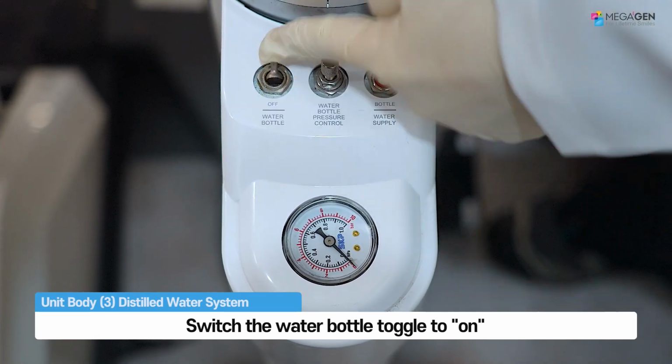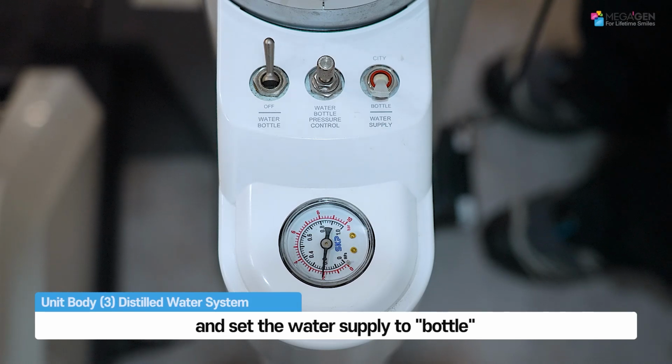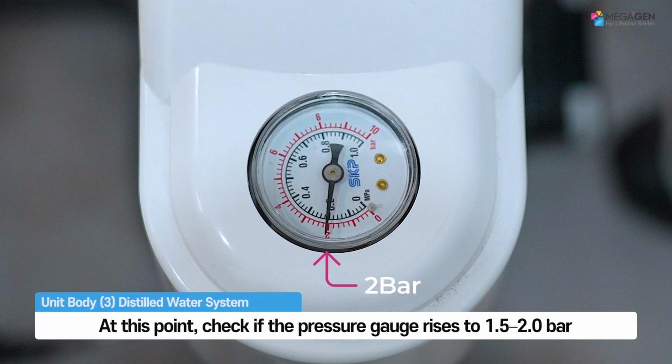Switch the water bottle toggle to on and set the water supply to bottle. At this point, check if the pressure gauge rises to 1.5 to 2.0 bar.